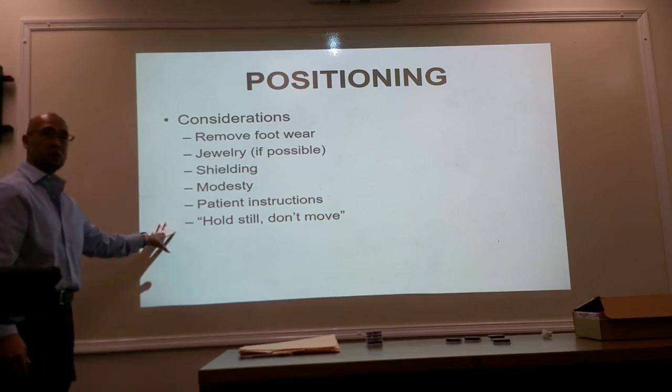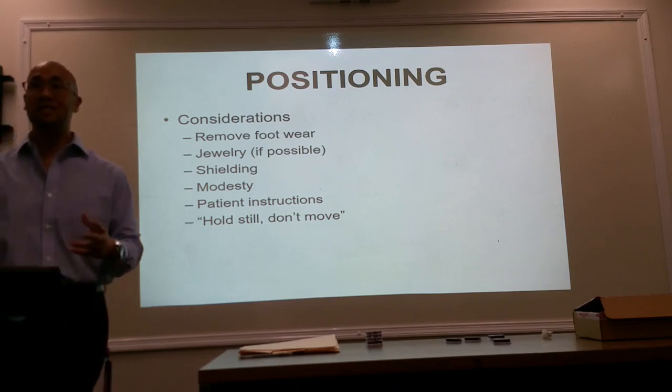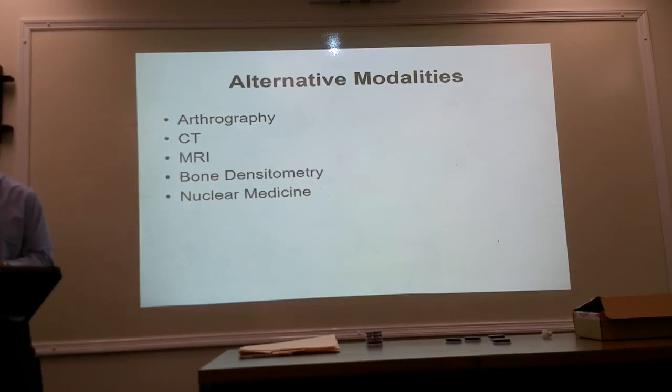Patient instructions. Are we going to have our patient hold their breath? Okay, simply we're just going to tell them to hold still, don't move.